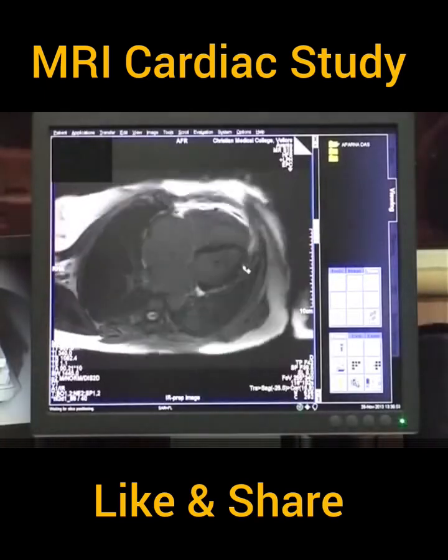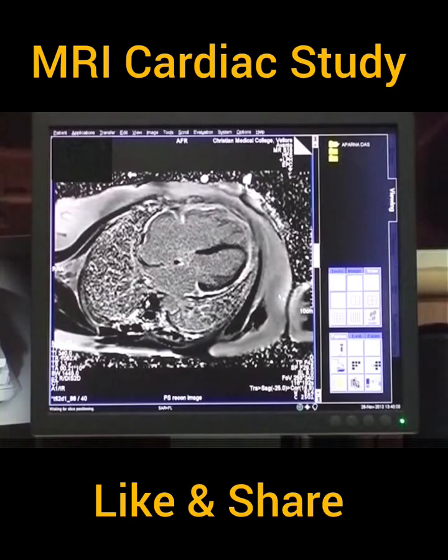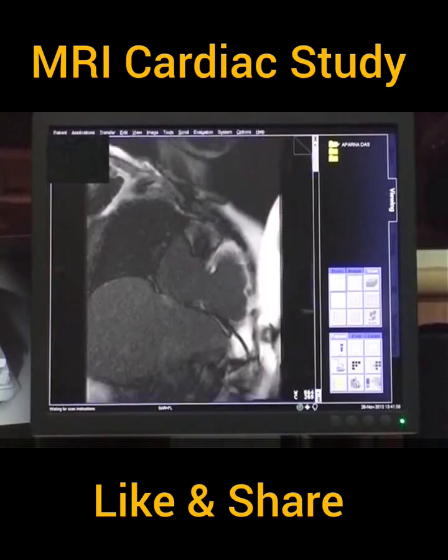Magnitude as well as phase-sensitive inversion recovery images are obtained, following which a delayed hyperenhancement scan is done in the 2-chamber view. A line is drawn through the left atrium, center of the mitral valve, and LV apex. The 2-chamber view is obtained in both magnitude and PSIR images.